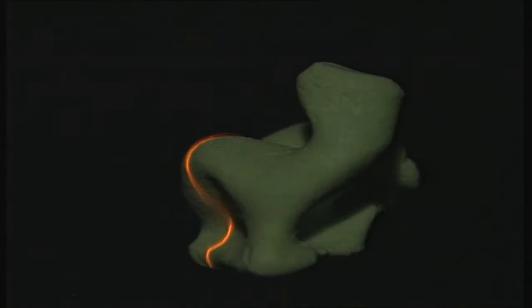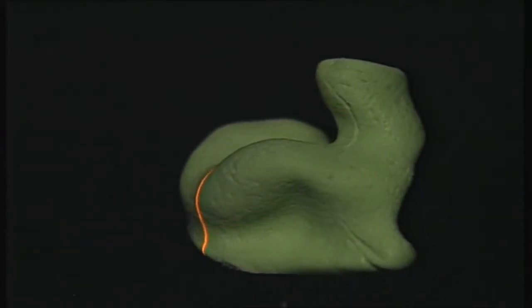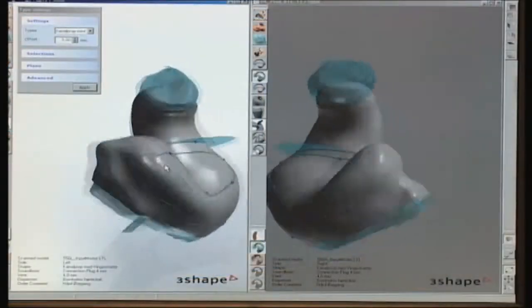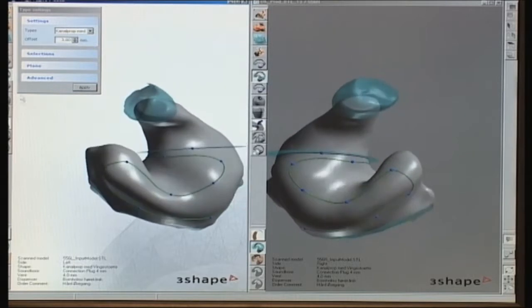The ear impression is placed in the scanner and scanned using laser technology. Data from the scanner are then transmitted to the Kamesha software. The Kamesha software creates an exact copy of the impression.